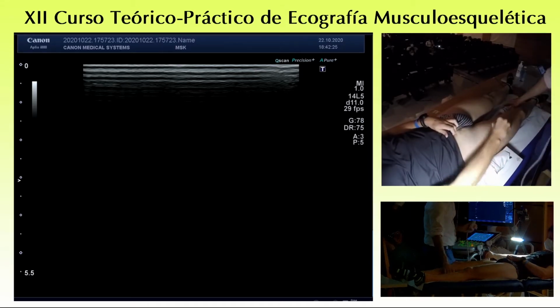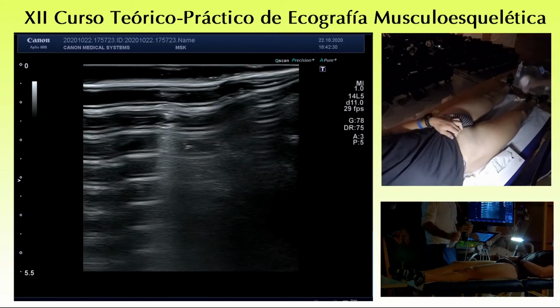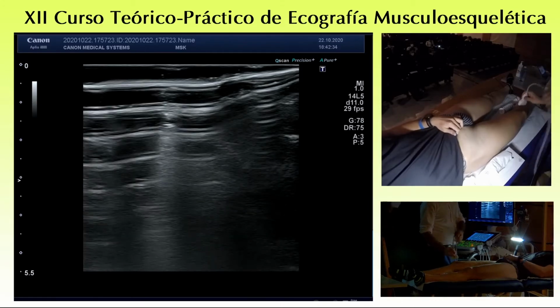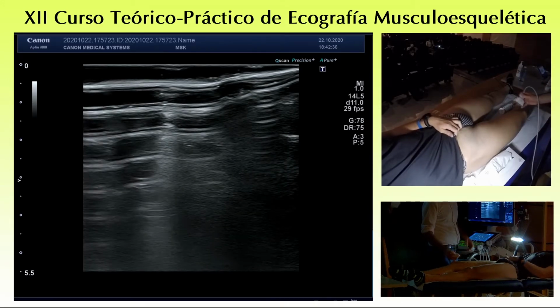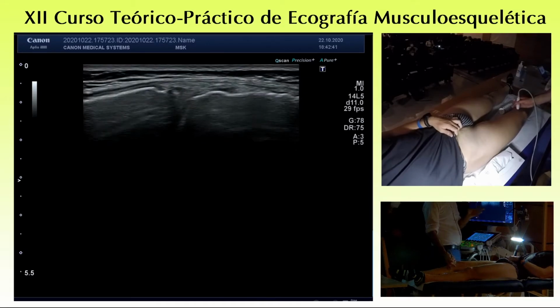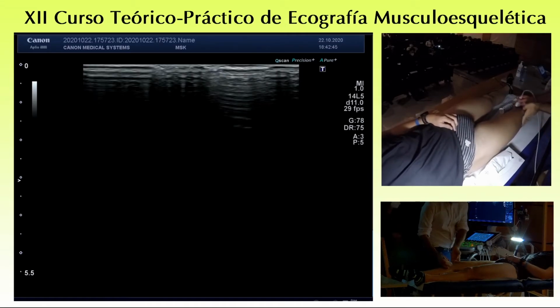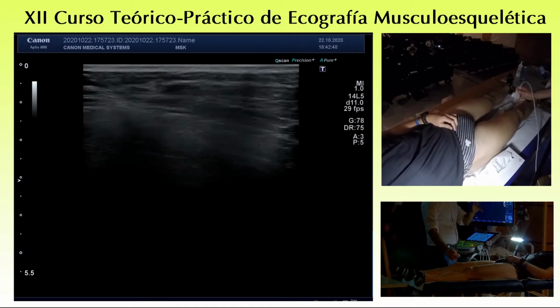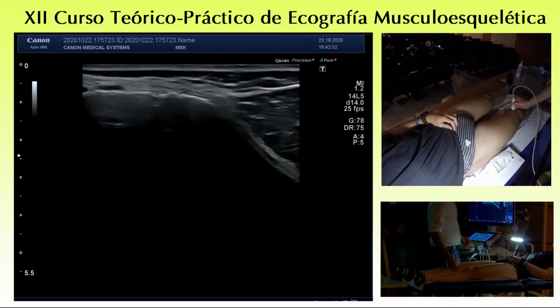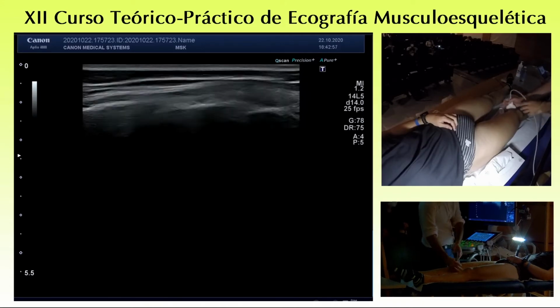So the genicular nerves are interesting because I know that they are spotted for injection in case of advanced arthritis, just to keep the symptoms under control. We have four genicular nerves: the superomedial, inferomedial, superolateral, and inferolateral. Most commonly, it's sufficient to inject two or three of them, and not necessarily all of them. So basically, the first, much easier to find, is the inferomedial.